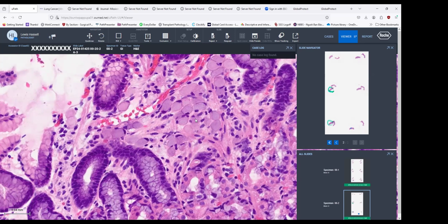I'm not sure that follow-up biopsies were particularly helpful, other than to say there's no visible lesion, and the random biopsies that were done from different areas of the stomach did not have either an in situ or any further evidence of this residual lesion. But the stomach is a vast organ, and small 2 or 3 millimeter biopsies are probably not going to be able to detect this.